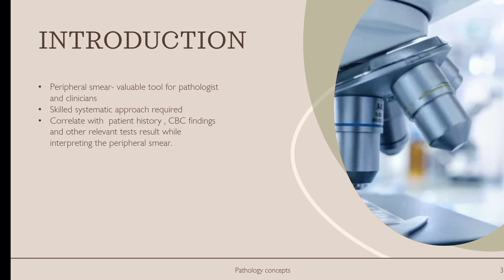Introduction. Blood taken by finger prick or venous aspiration is smeared on a slide and stained accordingly. The microscopy requires a skilled, systematic approach, which we are learning today in this topic.